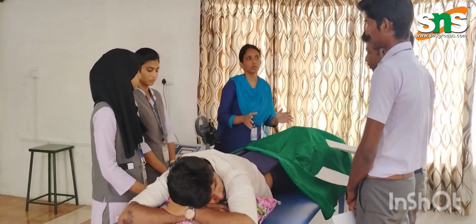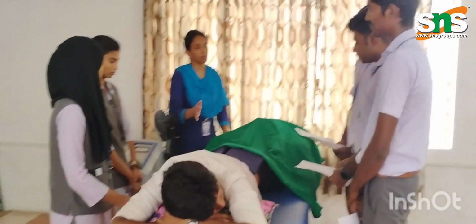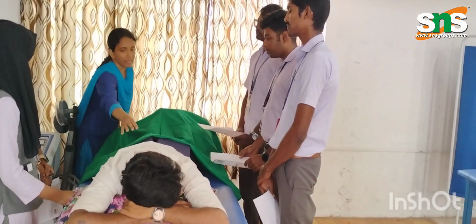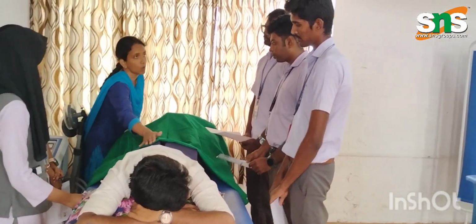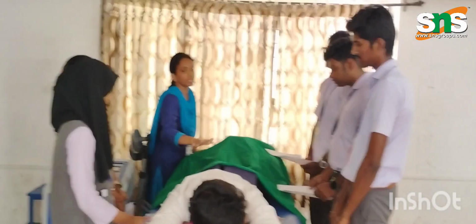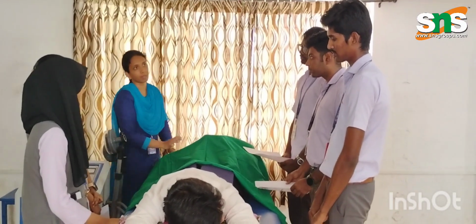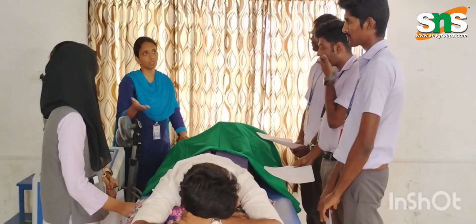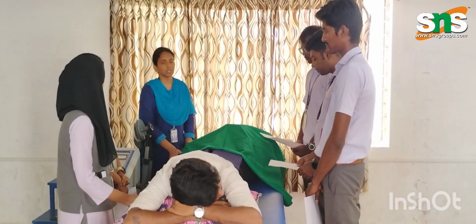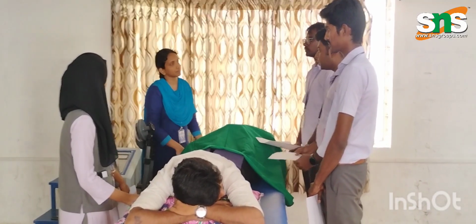In this case, we have positioned the patient in prone lying for better comfort, and we have used pad electrodes placed in the coplanar method so that a better outcome can be achieved evenly for the entire low back. As we said, the frequency and the intensity according to the tolerance of the patient should be monitored throughout the treatment session. So what is next?